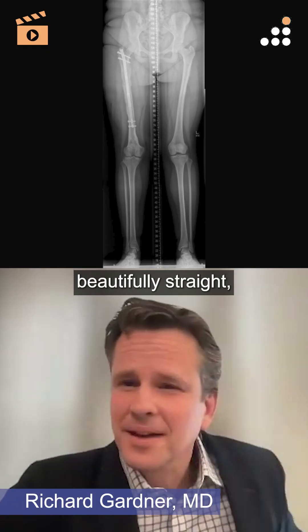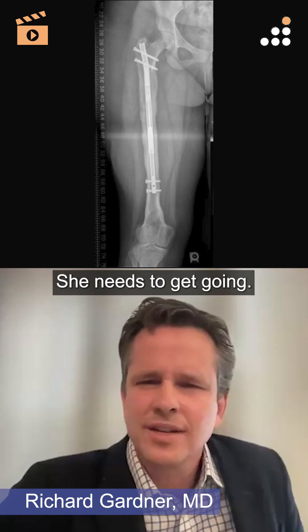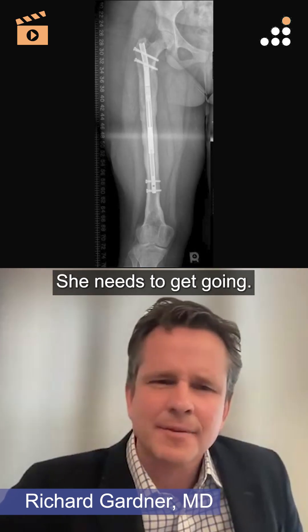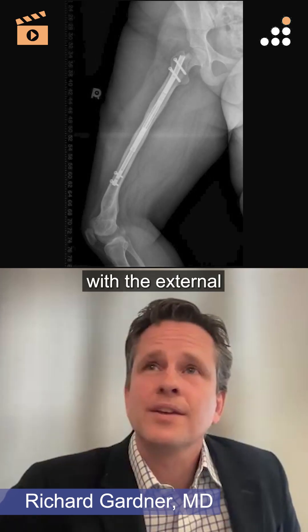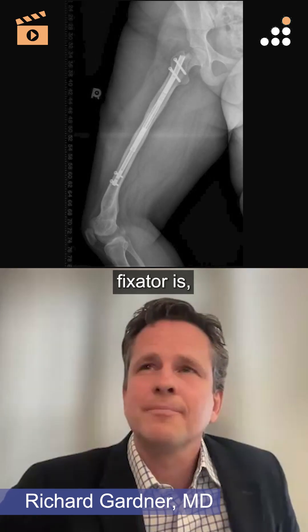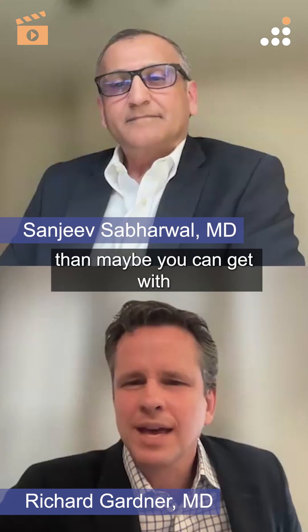You've got the leg beautifully straight on both coronal and sagittal planes, and that's just what she needs to get going. The osteotomy — I think the issue with the external fixator is that it does probably drive your osteotomy a little bit higher than maybe you can get with a plate.